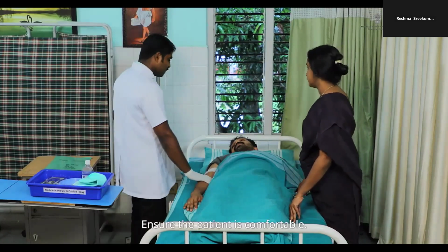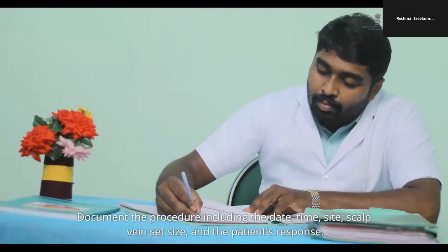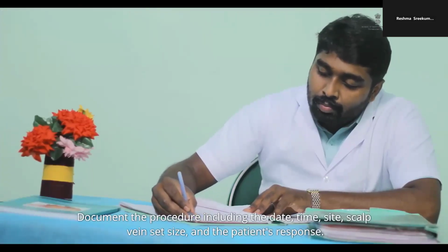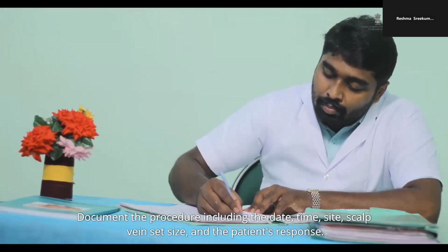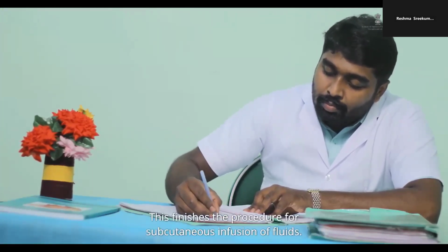Ensure patient is comfortable. Document the procedure including the date, time, site, scalp vein set size and the patient's response. This finishes the procedure for subcutaneous infusion of fluids.